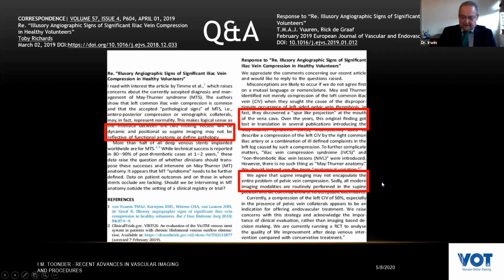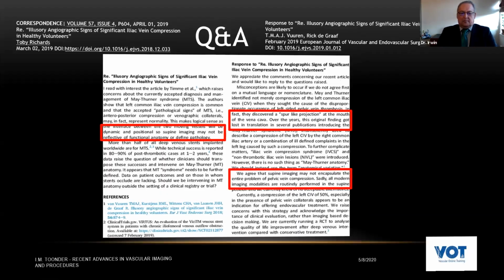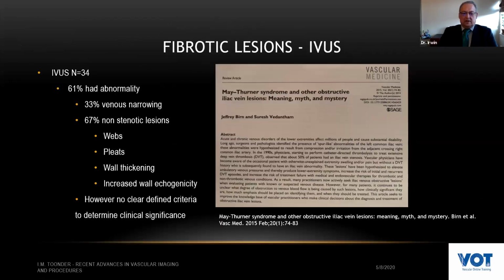And that's why I'm an advocate for duplex. I believe that you should use the duplex in a proper way with the proper skills, and we'll get a more accurate picture of what really would be a May-Turner.